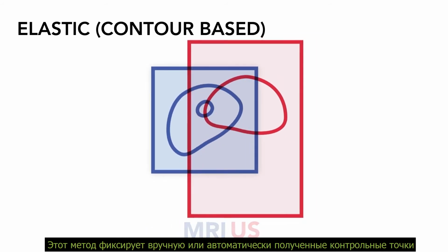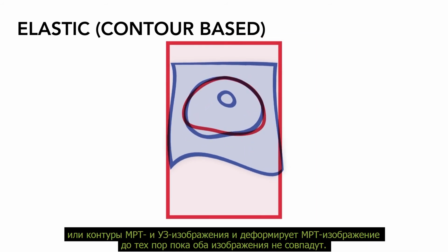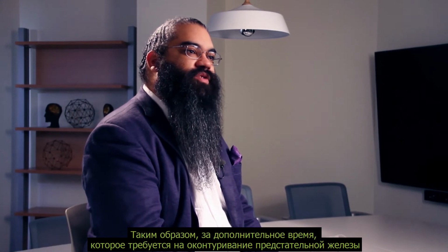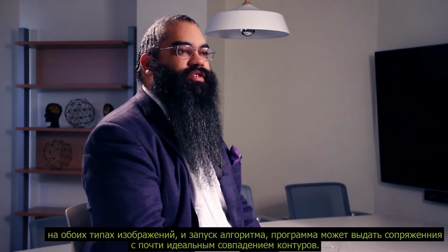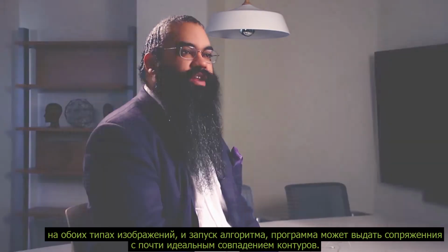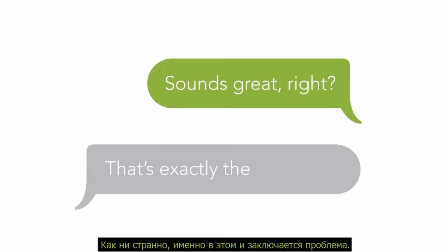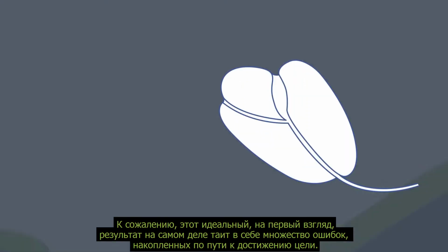This approach takes manually or automatically identified landmarks or contours on the MRI and ultrasound and deforms the MRI until they match. So for the extra minutes it takes to contour the prostate on both images, and the time it takes to run the algorithm, the software can give a registration which will match the contours nearly perfectly. Sounds great, right? Ironically, that's exactly the problem. Unfortunately, that perfect-looking result is actually hiding all the errors accumulated along the way.